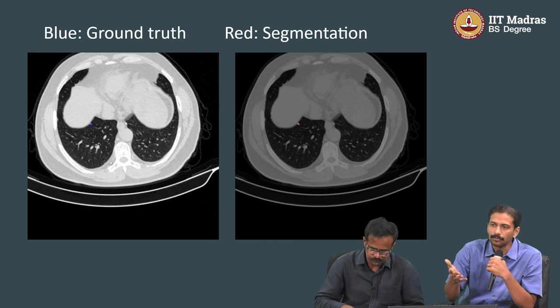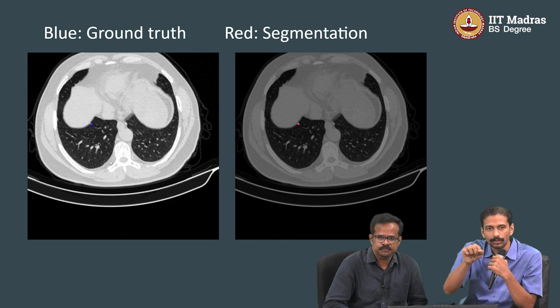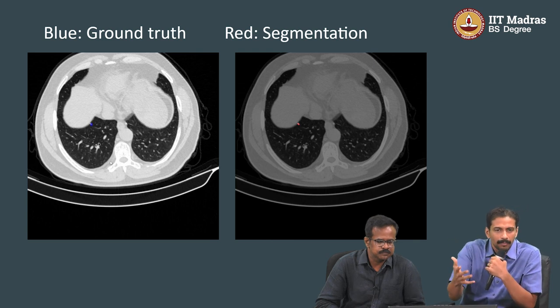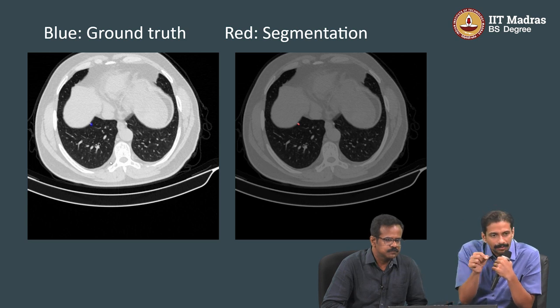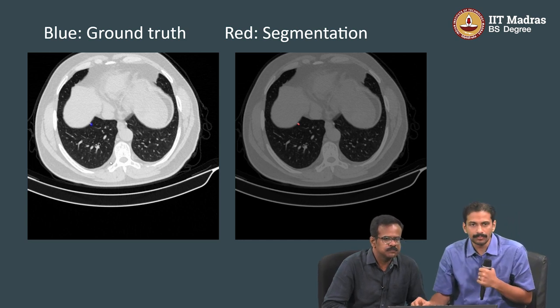So we wanted to create a semi-automatic tool. If you just load the patient, it will be able to locate the nodule and segment it out. Draw a contour and segment the volume. We wanted the volume for other purposes, but the initial segmentation was a tedious process. There will be 10 slices across which the nodule is present, and there can be 20 nodules in the lung. It's very difficult to mark them out, right? So the need was an automated or semi-automatic algorithm which will run through, pick up the nodule, and segment it. So we did that.